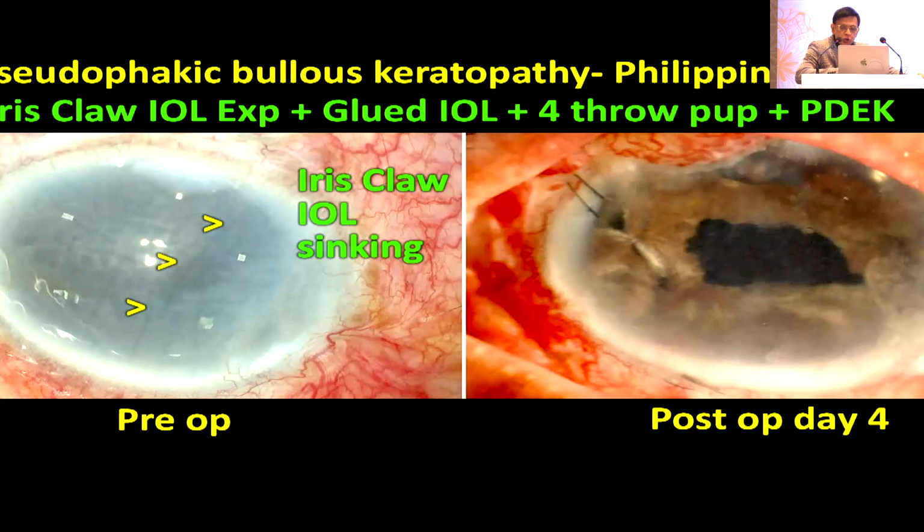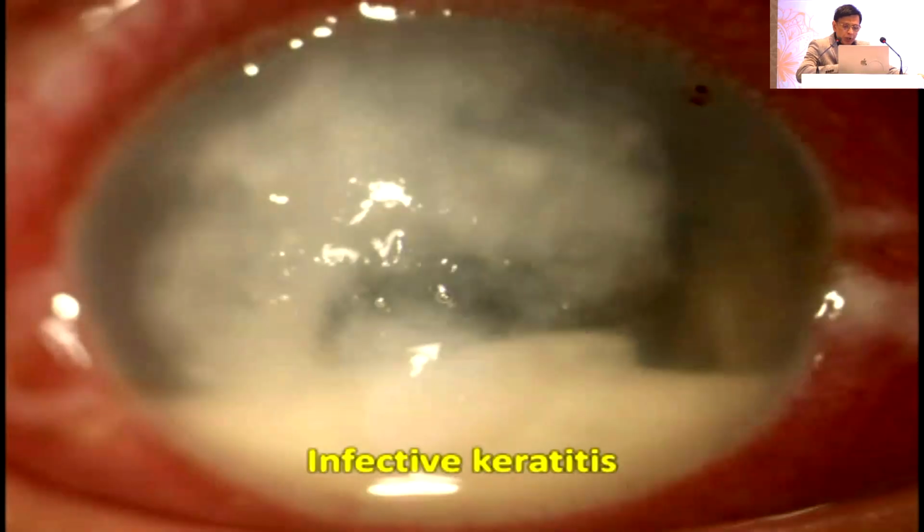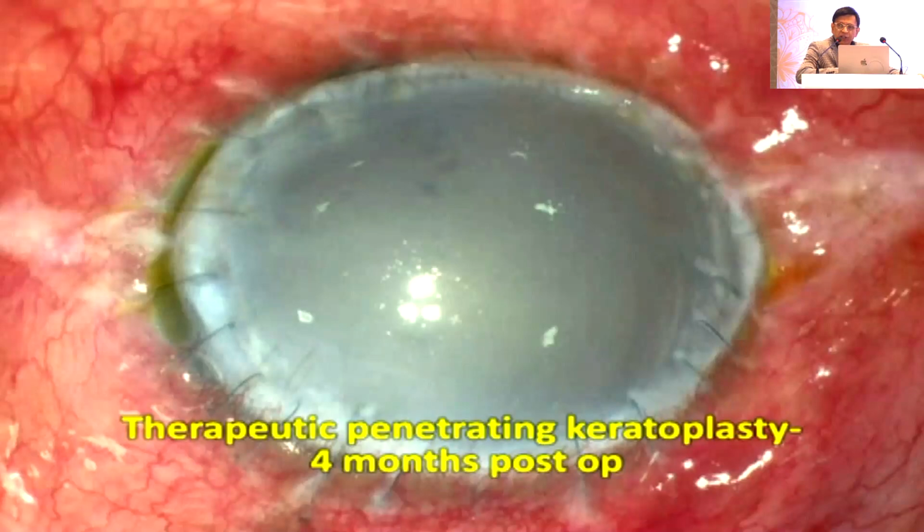Look at the patient post-op day 4, and look at the same patient post-op 2 weeks, vision improved to 6/12. And look at the pre-op, how bad the cornea is. I couldn't see anything. And that's the patient post-op. Look at this picture here, infective keratitis. So bad was the cornea, they did a therapeutic penetrating keratoplasty.